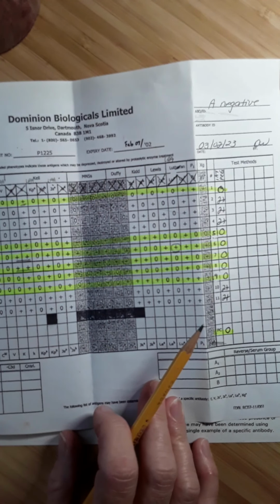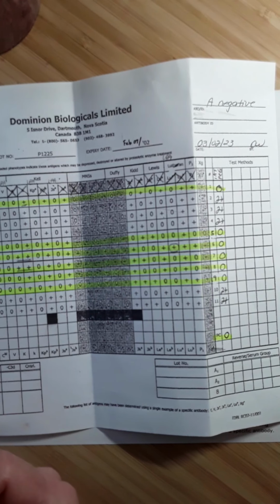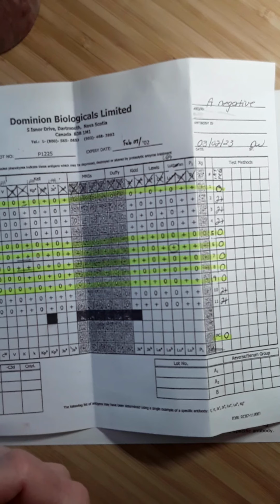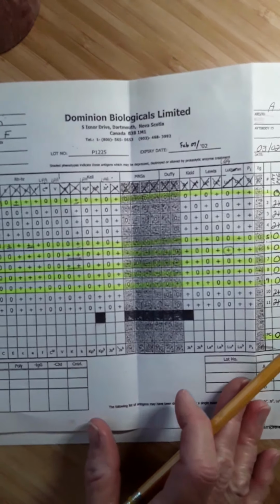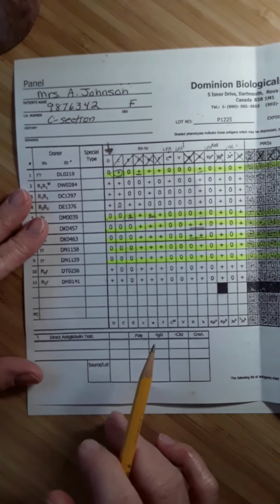The last step we have is over on page 11, and the last thing that we need to do is do an IAT cross-match of the patient with some donor units. And whenever we have to do an IAT cross-match, we would do that right away, unless this was a pre-op patient, so their surgery booked at some point in the future. We would wait to the day before their surgery to do the cross-match. But this lady's an inpatient. It doesn't mention that she's pre-op. She's going for a C-section, which I realize is a surgery, but she's an inpatient.